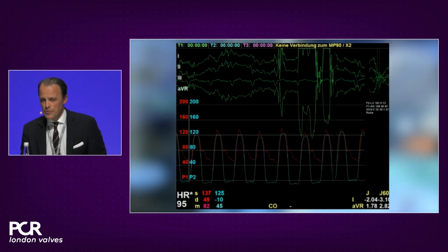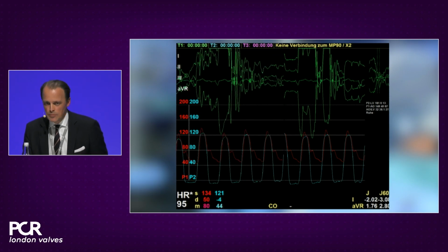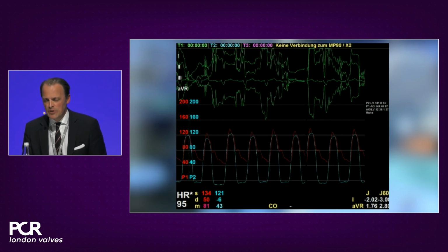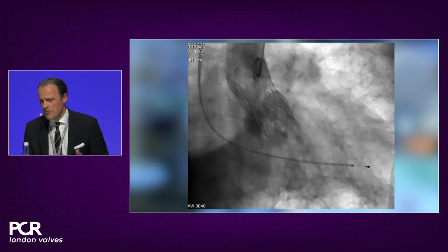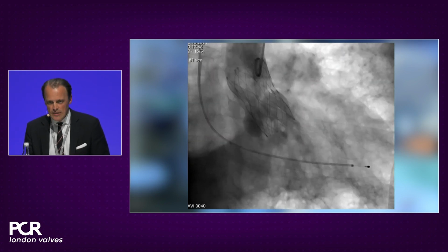Anyways, once the valve is in, we do repeat the invasive measurement, good dicrotic notch here, good diastolic pressure separation. We've eliminated the stenosis, I think it's very obvious. And the last part of the procedure for us naturally is an injection of contrast here with the good valve height, good coronary perfusion, good result, good sealing. So we're at the end of the case.